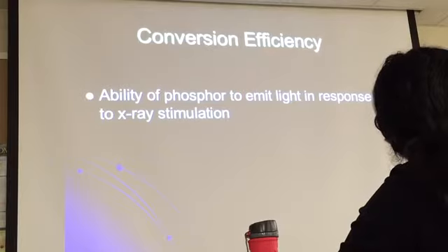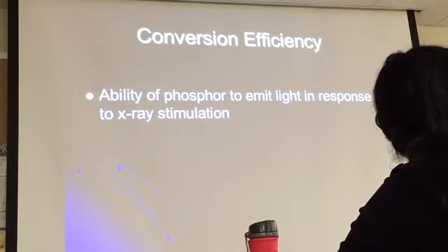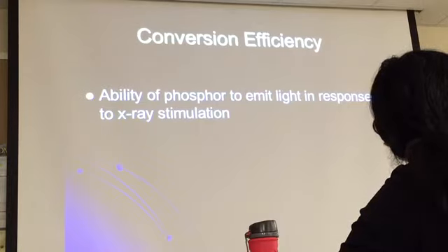If it doesn't absorb, and this is kind of related to what we're doing in 415, if the X-ray is just going through, nothing happens, right? It's not interacting with anything. So you want it to interact, you want it to be absorbed, because when it absorbs, it can give off its energy. In this case, it's good.